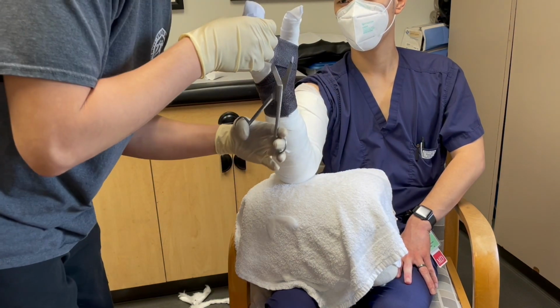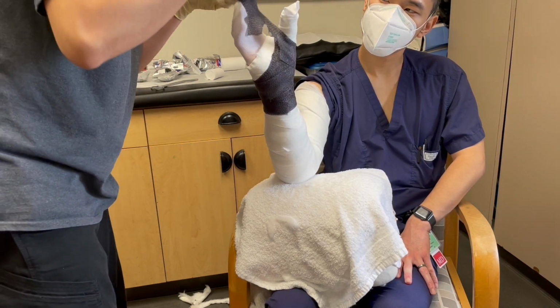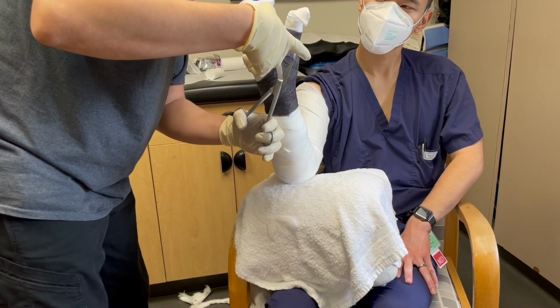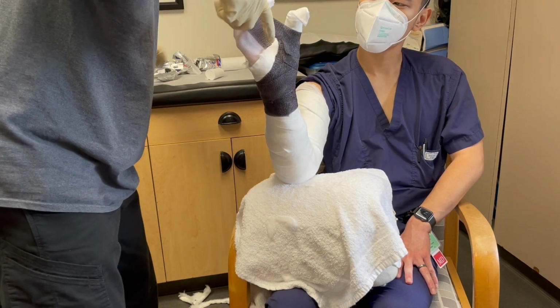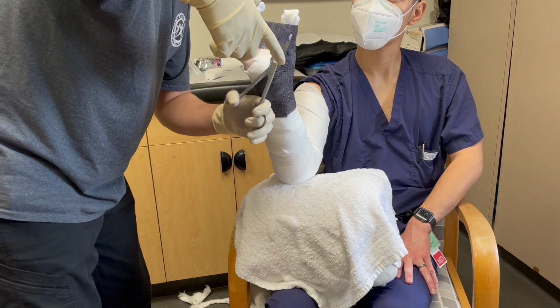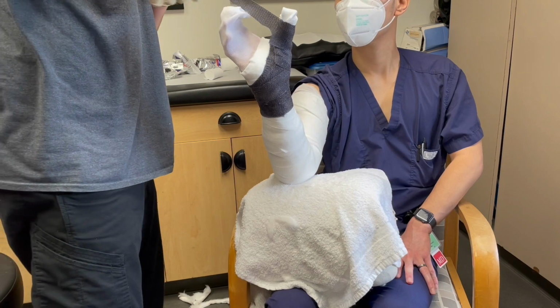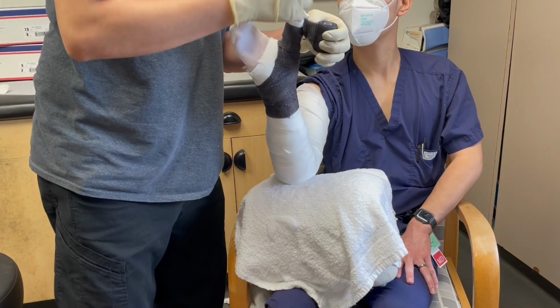Now if we were to do a thumb spica, we would make another L-shaped cut as you see here and wrap the thumb. As we wrap the interphalangeal joint, we can make another L cut, but this time cut up half of the fiberglass tape and then wrap it around.